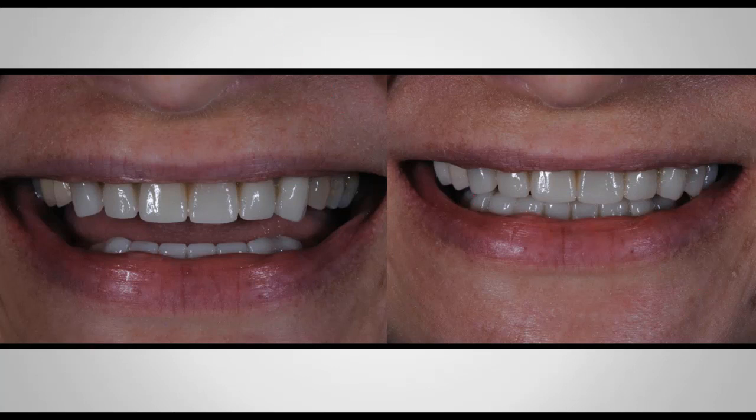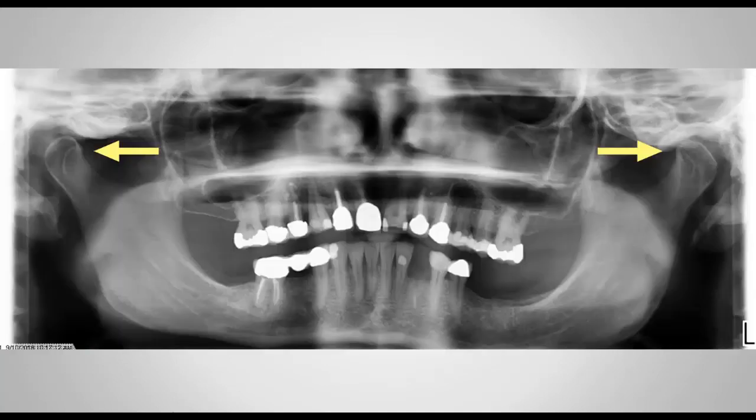But you know what? The most important aspect of this case, and the thing that I want to show you here, is the panoramic X-ray. This panoramic X-ray that I'm showing you right here, the first one that I'm sharing with you, was taken before I did any prototypes.